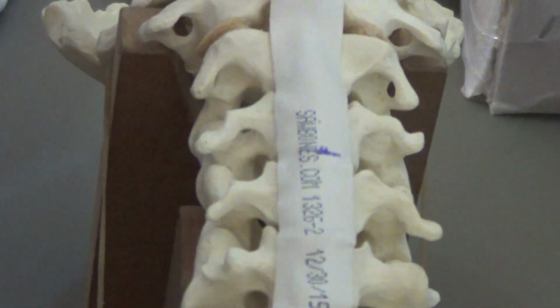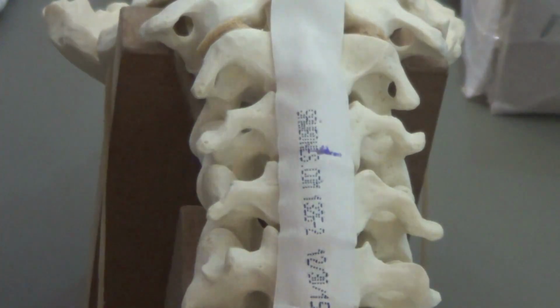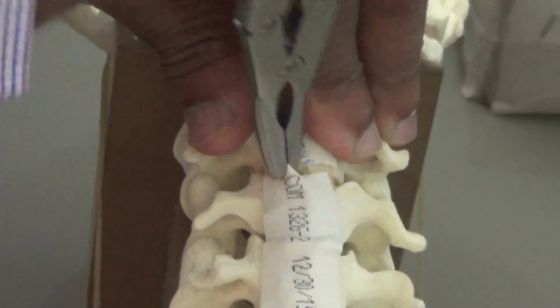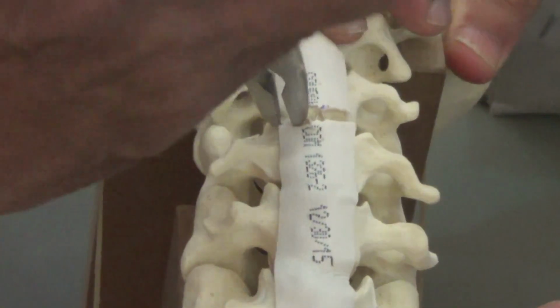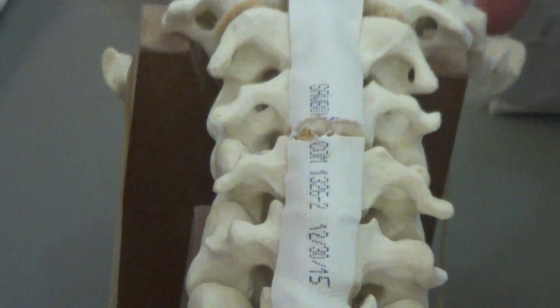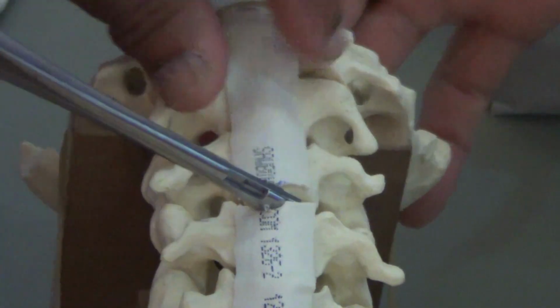How do you excise the disc? After cutting the annulus, you have either a ronger, and then you take out the disc slowly. Once the disc is taken out, at this juncture you can distract further so that the disc space is wide. Then you have a small pituitary forceps, and then take out the disc.